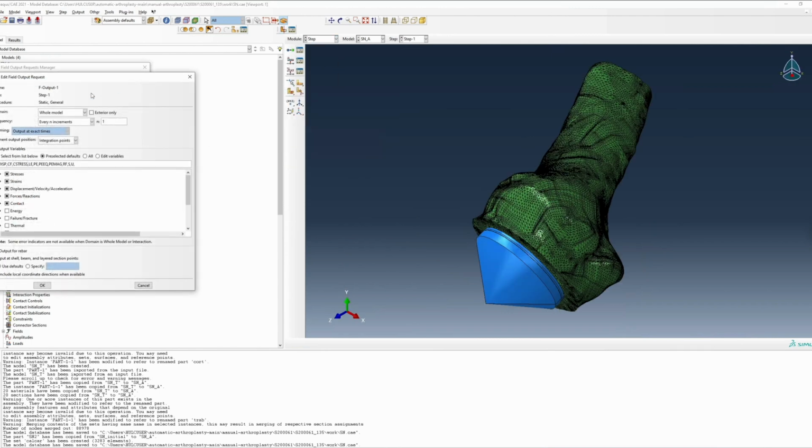Once you've completed all the pre-work required for your field output variables, it's time to assign what output you'd like to see from Abaqus. Remember that the more targeted your field output variables can be, the less memory and computational power your analysis will take. This can be extremely important as the output database files for one of these analyses will be upwards of 5 gigs.